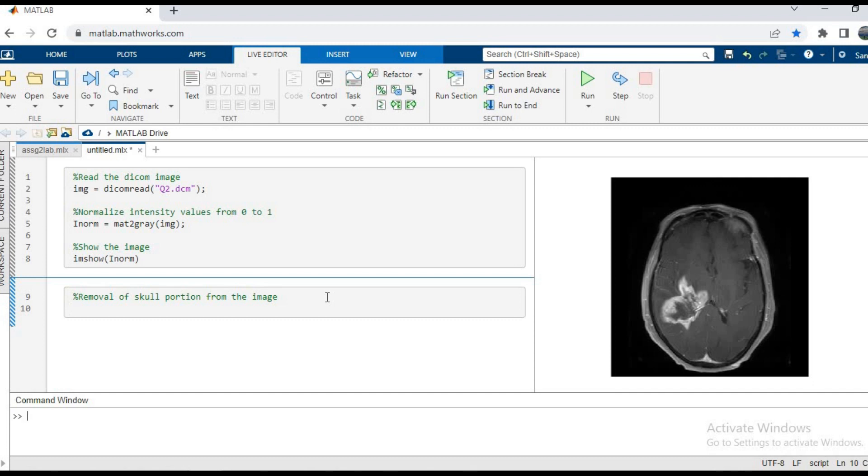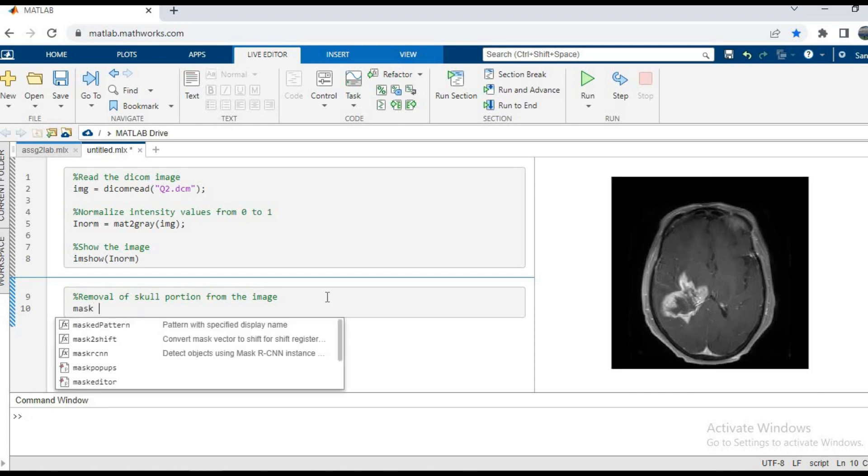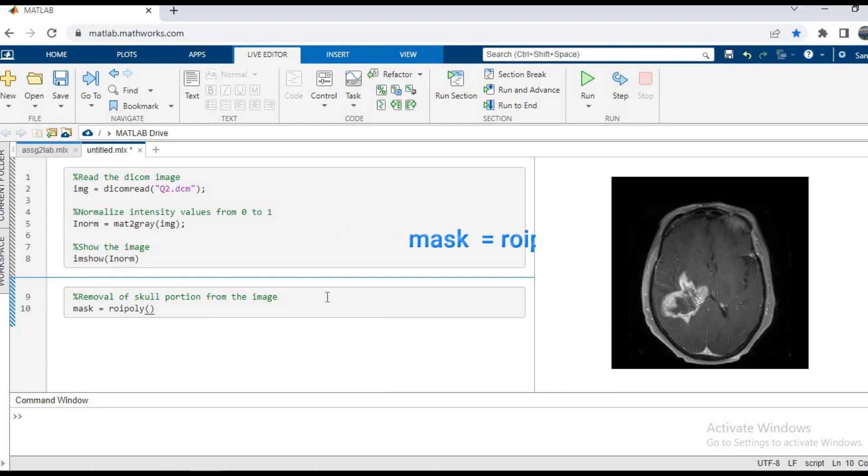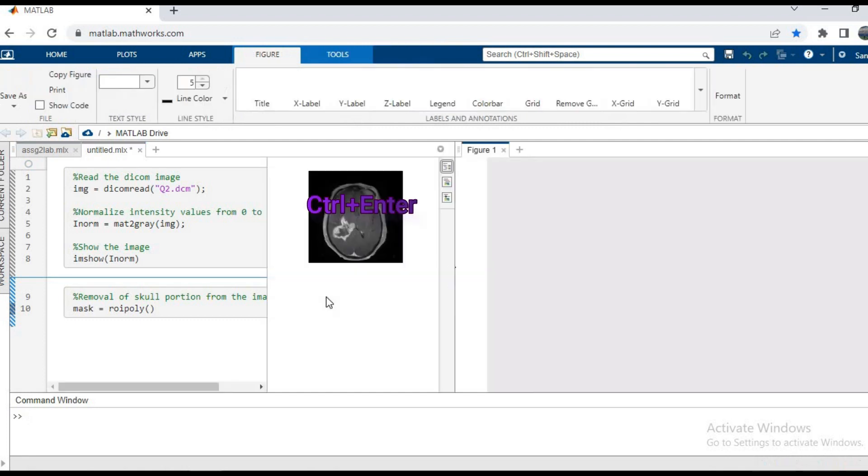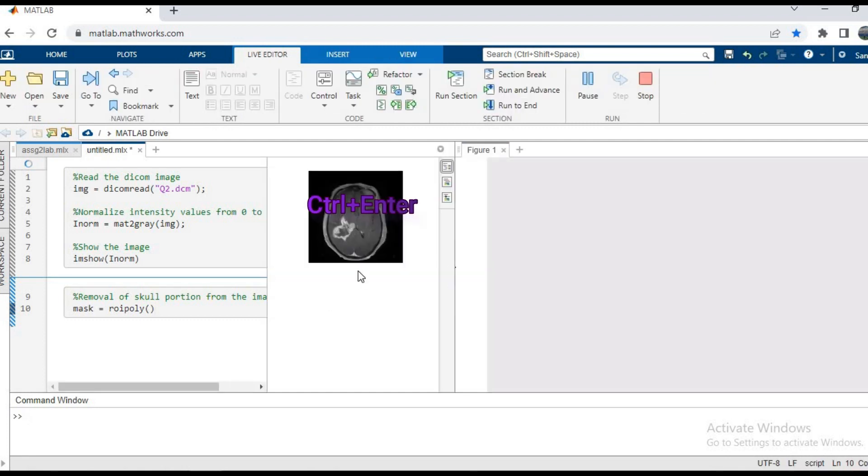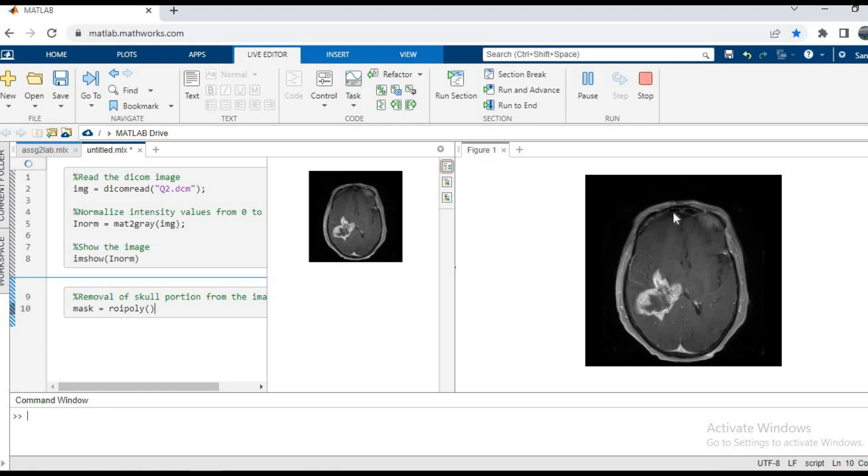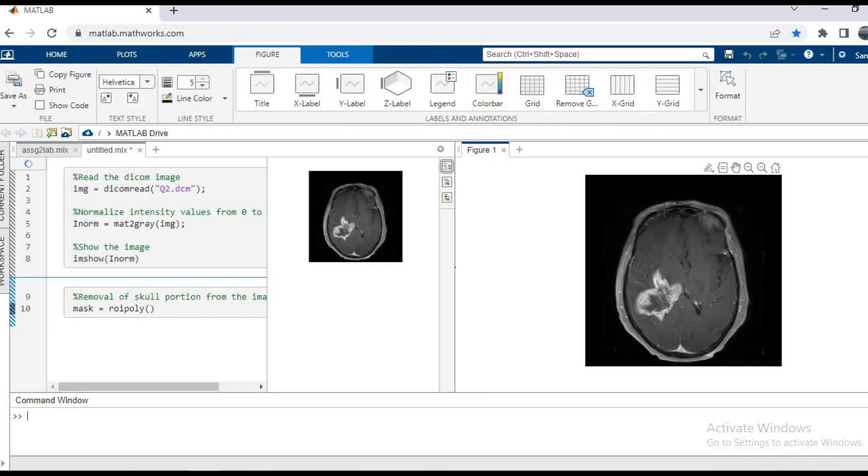To do that we'll be using the roipoly function. First we'll type mask equals roipoly and press Control+Enter. This is what happens - we can see that this figure is being shown to us where we have to select the area of interest which is required. Using the cursor I'm going to select points around the brain tissue.